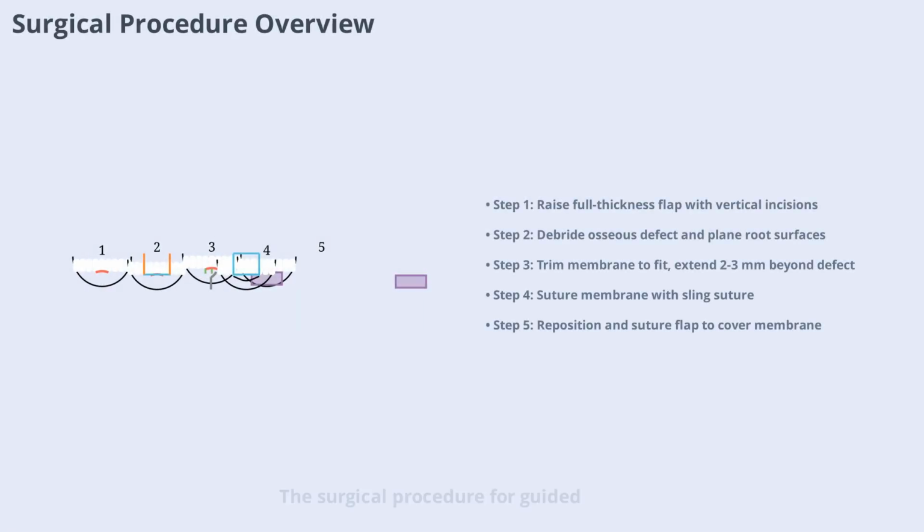The surgical procedure for guided tissue regeneration involves several key steps.